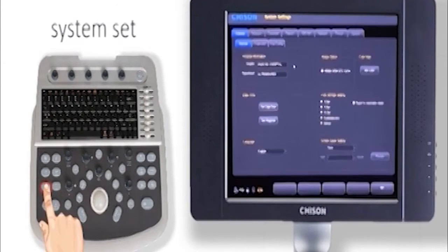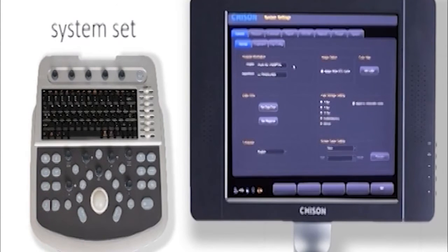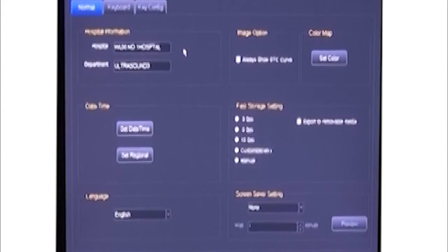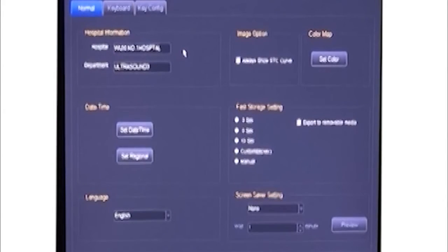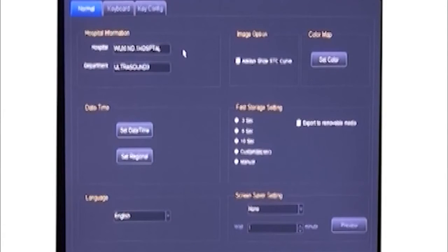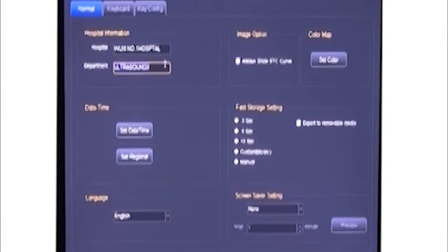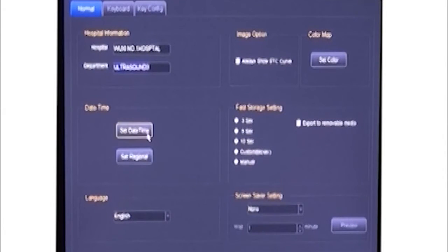Press the system setting key. First, we can input hospital information here. Different may be in different time zones, so we can use regional setting.